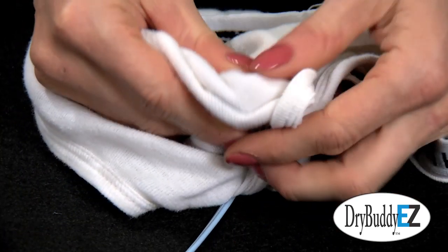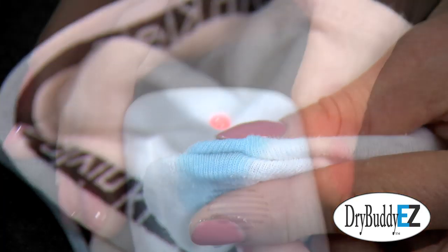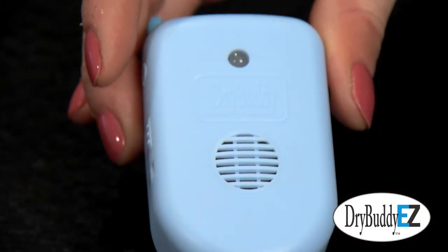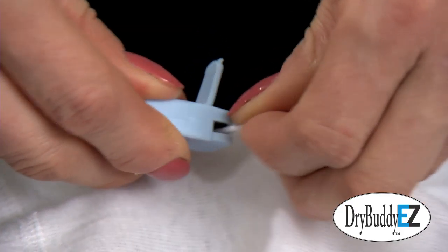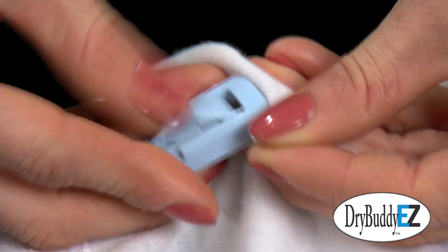At night when the alarm sounded, it was very easy to turn off the alarm and then unclip the alarm from the wet briefs. The alarm could be quickly rinsed and dried by clipping it to a dry cotton cloth.